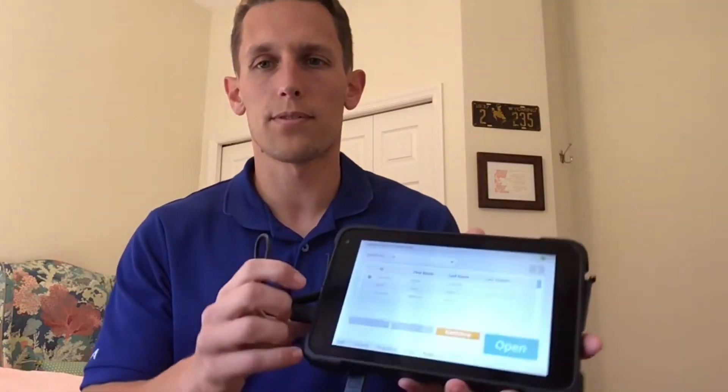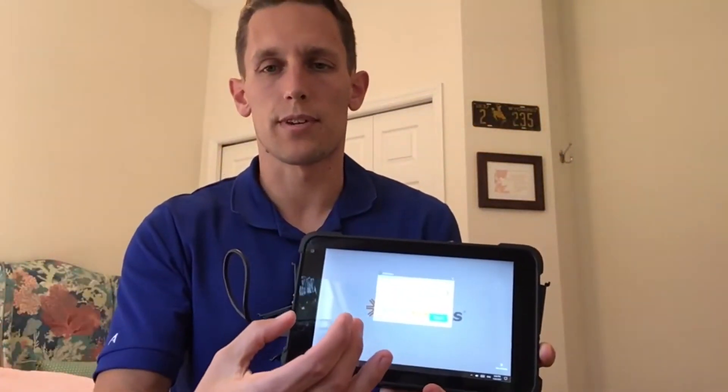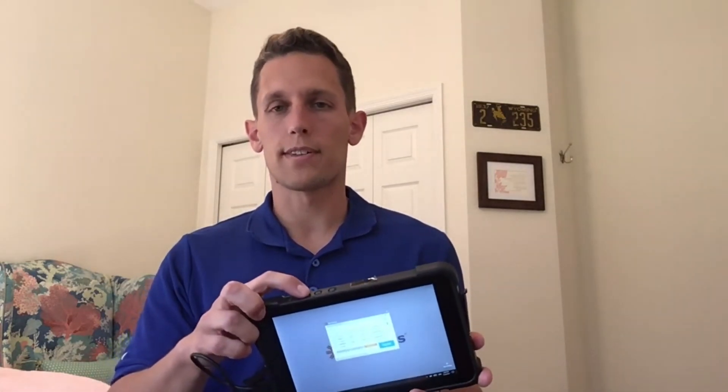Lastly, if the program freezes — one thing you can do is swipe from left to right, which should minimize the screen. If the screen can be minimized, there's an X logo at the top; click that and restart the program, which should resolve it. If you can't minimize or close out of the screen, it's more frozen, and that's when you need to do the hard reset: hold the top of the tablet for 30 seconds until it turns off, then hold again for a couple seconds to restart the programmer.